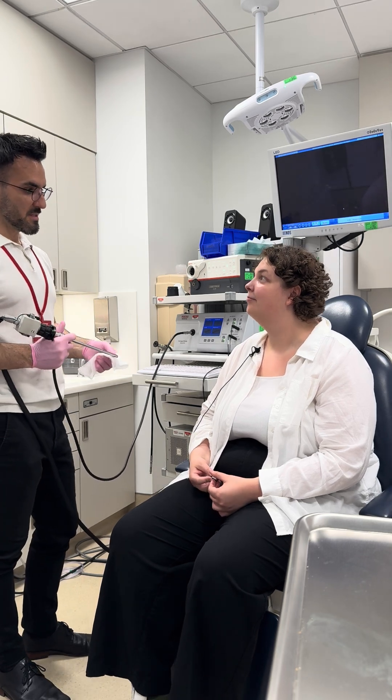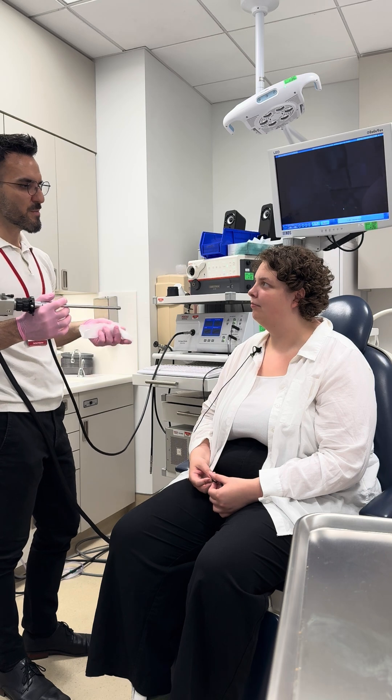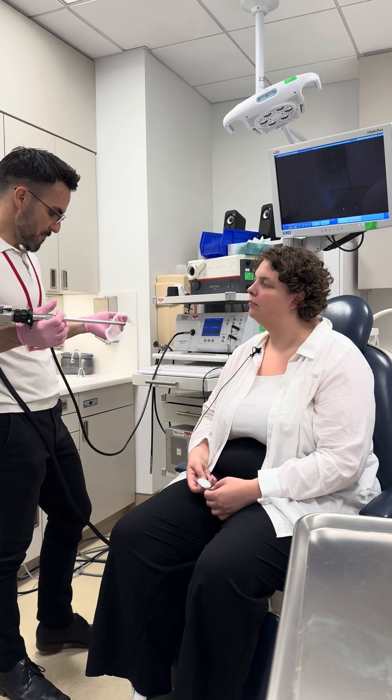All right, we're gonna take a look at your vocal folds now. This is a scope that's gonna go into your mouth just to about right here. You might feel it, it might make you gag, it'll probably kind of come out and go back in a couple of times. First thing we're gonna do is just look to see how your vocal folds are vibrating and moving, okay?